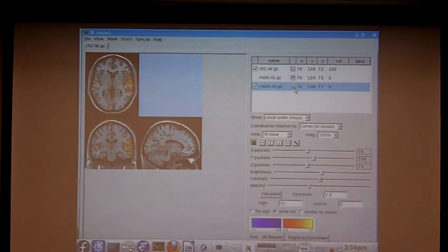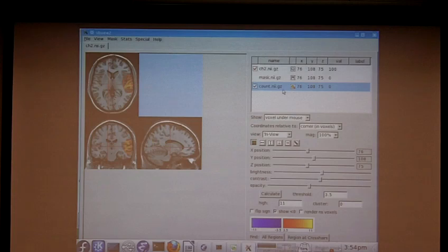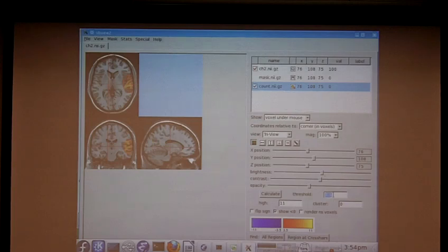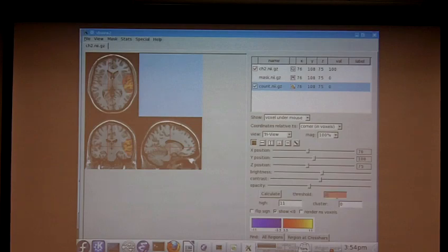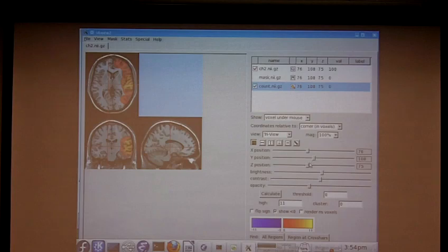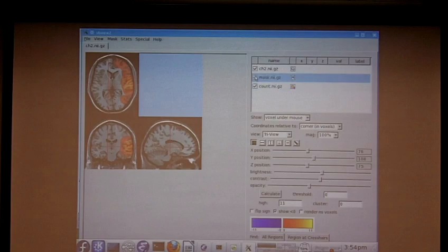The count map is, I loaded it up as a statistical map. And by default, the threshold for statistical maps is 3.5. That was to preserve backwards compatibility with antique versions of Voxbo. Let's set it to zero. So this is basically everywhere where we have at least one lesion. You can see it's a little different from the mask.